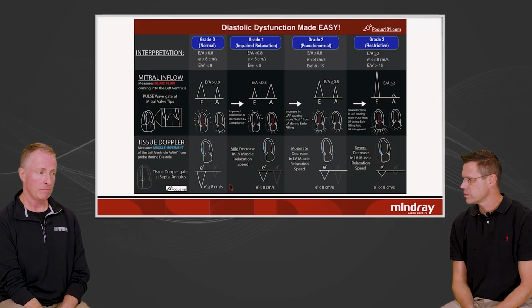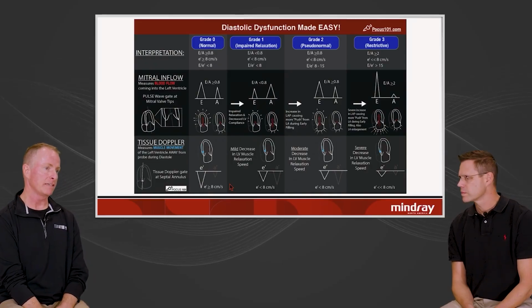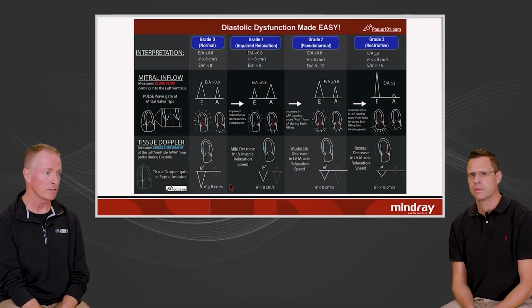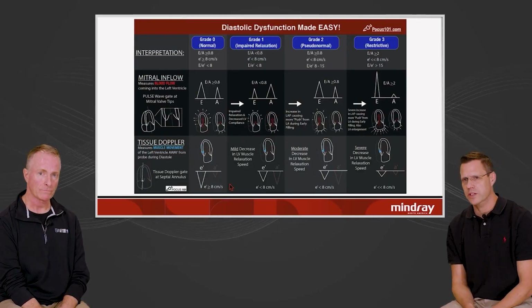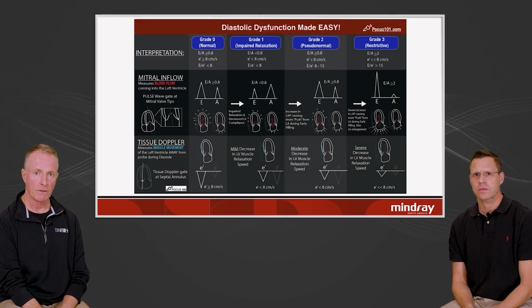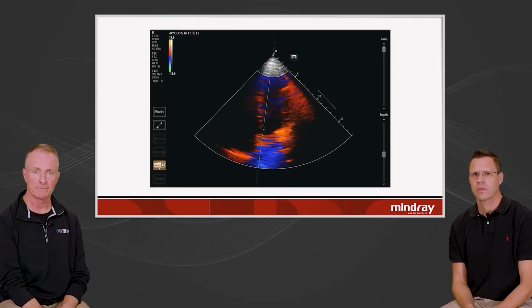studies show that patients who are in septic shock with significant diastolic dysfunction have a higher mortality, which kind of makes sense. They're so hard to resuscitate. And being able to guide the resuscitation based on what's actually going on with their heart is just invaluable. Yeah. These are the patients you might want to do those measurements that we talked about on.